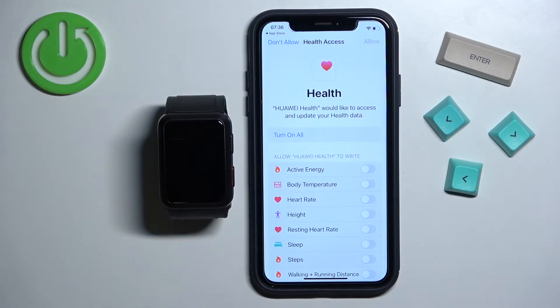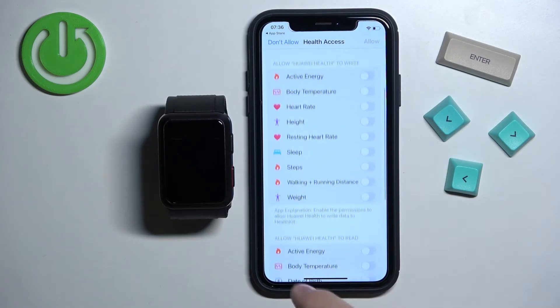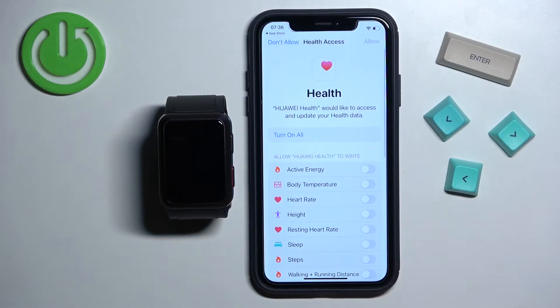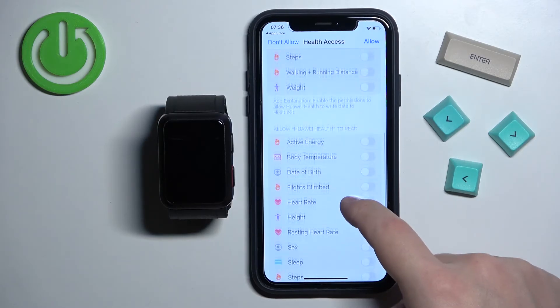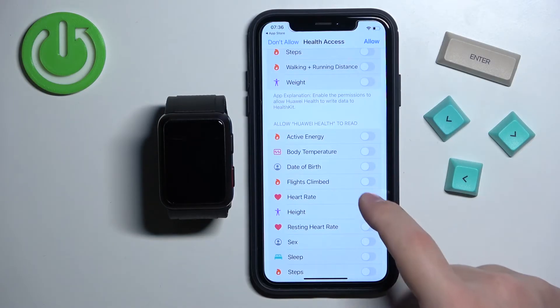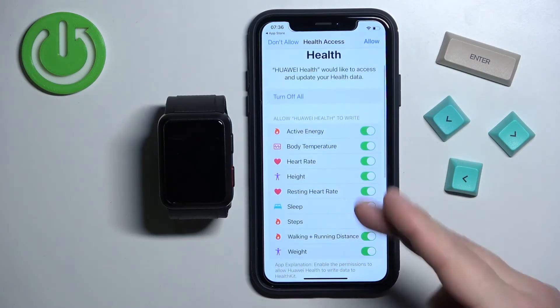On the Health Access page we can allow features like heart rate, resting heart rate, and similar data — basically allowing Huawei Health to write and read data for them. You can customize this list by tapping on the switches. For example, if you want the app to be able to write or read heart rate data, tap to enable it. I'm going to tap on Turn On All and then Allow, but you can customize it to your liking.